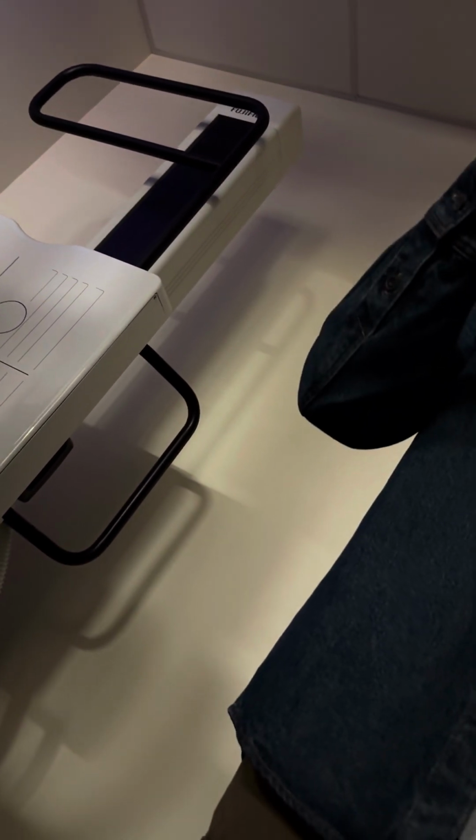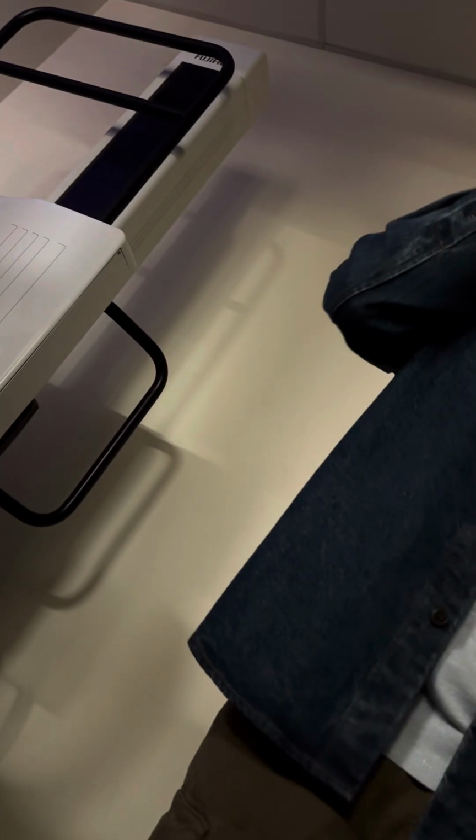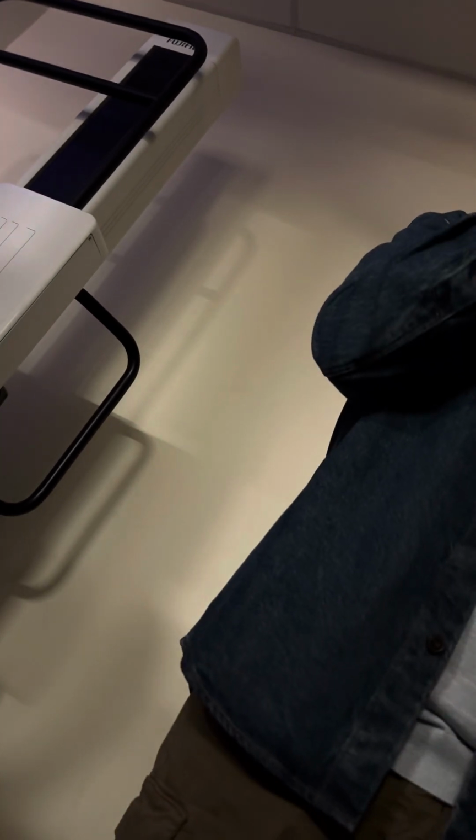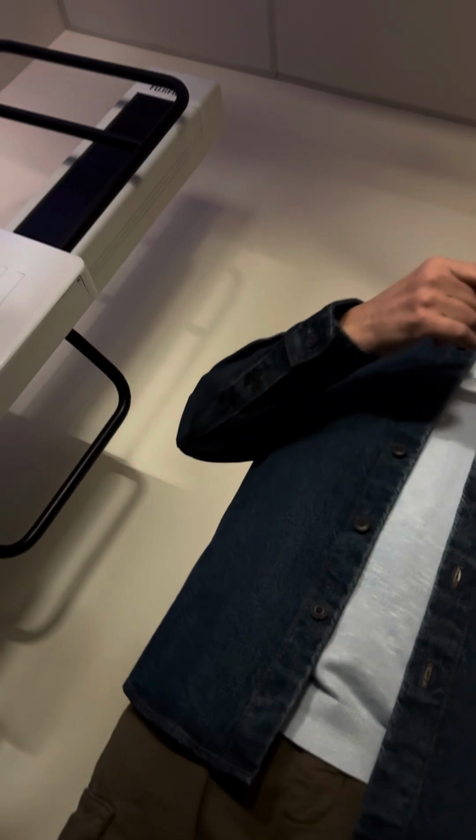SMV holds the same. The book will tell you there's differences in the SMV, right? If you read it, one's like 3/4 inch off, away from the EAM. Most people have that much between their EAM and their outer canthus, so there's not a lot of room to do it. We just place it in the middle of it for all of those views.